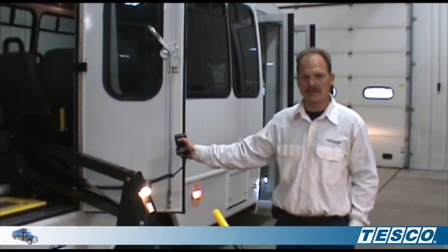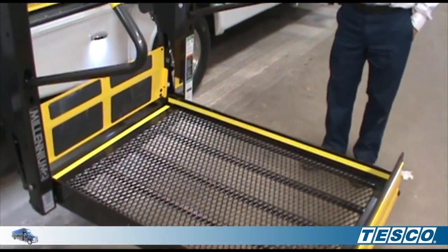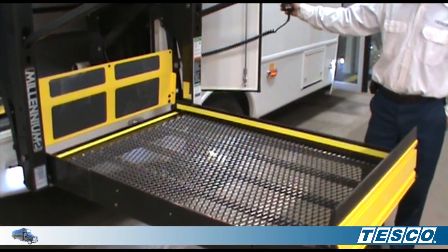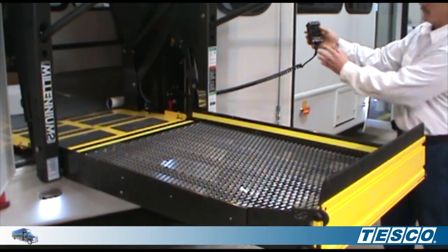Now we're ready to raise the lift. Simply hit the up button, followed by the fold button.